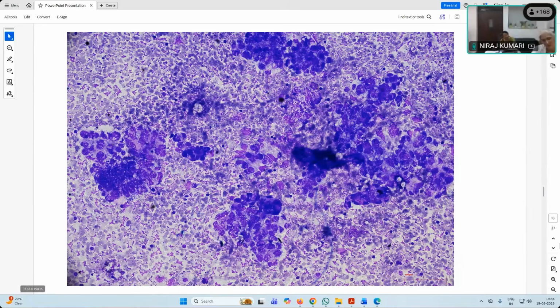If you have this kind of round blue cells, which rhabdomyosarcoma would you think of? And the age is 3 years. Embryonal rhabdomyosarcoma. So all these come clinically in the DD. But once you see the background, so should you continue? Yeah. So let me just drop a hint for all of you.